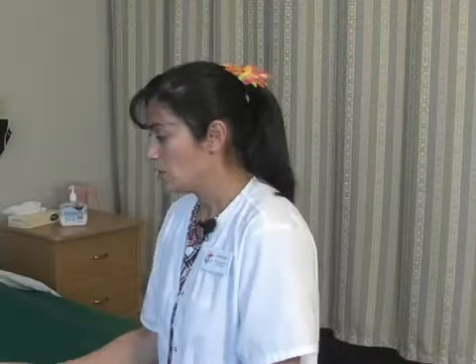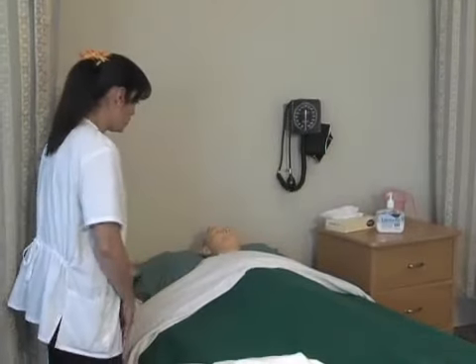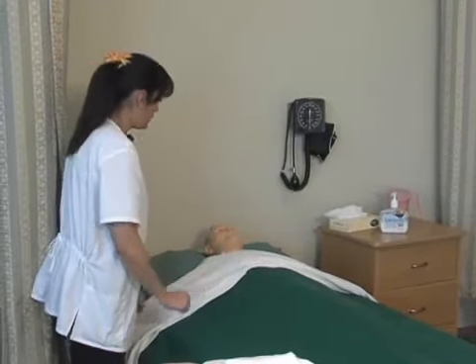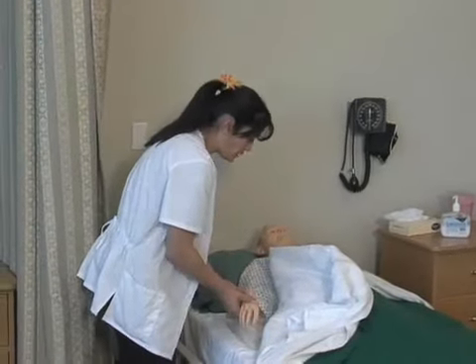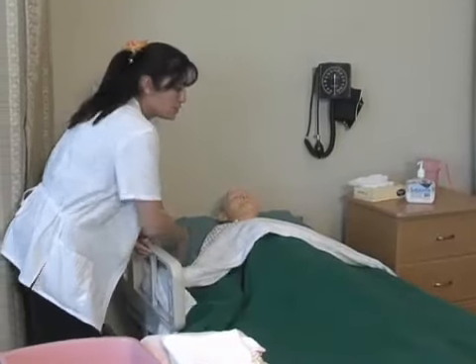Okay, so I'm just going to go in my patient's room. I'm going to walk in. Hi, Mr. Jones. I'm Marta. I'll be your nurse today, and I just need to provide catheter care on you. I will identify, make sure I have the right patient, which I do. I'm going to raise the bed.